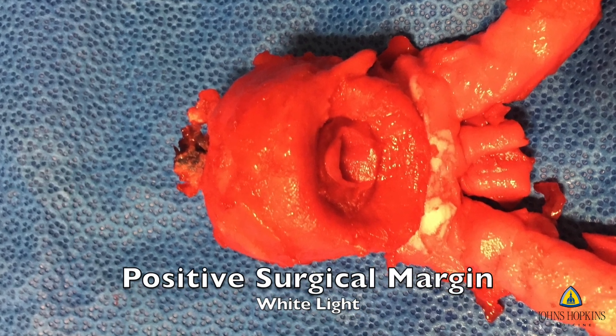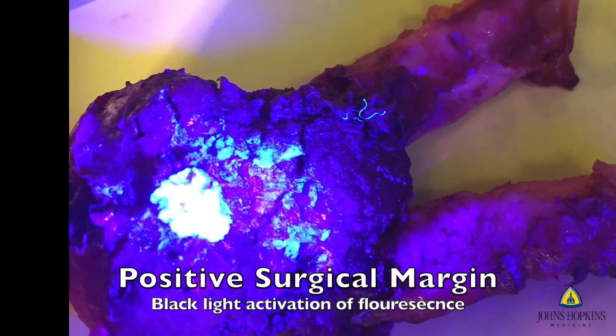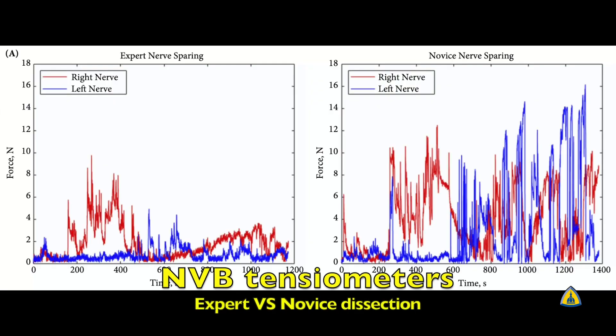The surgical margins involved a unique trick: the prostate was infused with a fluorescent dye, so when you turn on the firefly, you can see areas of positive margin. Here you can also see the difference in neurovascular bundle tension data between an expert and a novice.